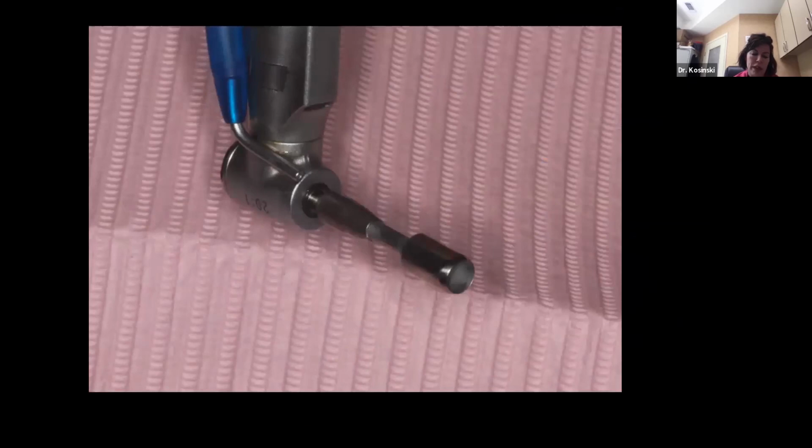A tissue punch is used to remove the epithelial tissue over my osteotomy site. In my final preparation, I do not want to push epithelial tissue into the osteotomy. This can result in failure of the implant. The burr is purchased from Salvin Dental in Charlotte. It is simply a circular stainless steel burr.